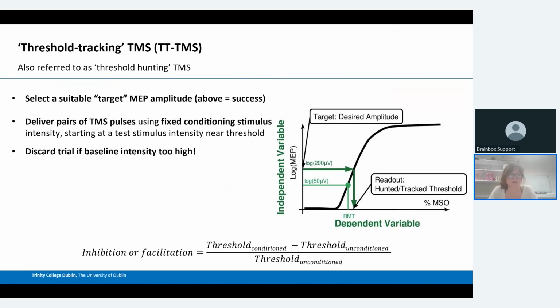What's important about that is because you're doing this online analysis, you can't afford to leave in noisy trials and bin them later. You need to constantly be rejecting data that's not suitable for analysis and then replacing it. So you have to have built into your online program some criteria by which, when your EMG data is collected, it checks if the person had too much background activity, and if they do, bin it and do another trial to replace that.